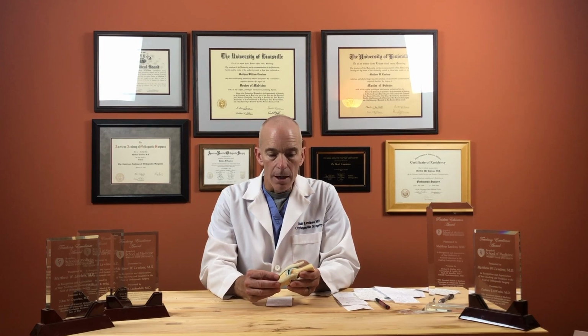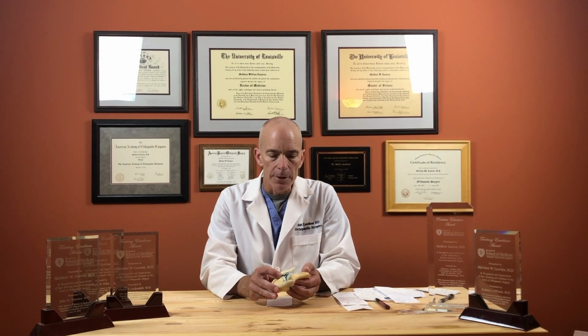There's currently a very popular way of doing it with what's called a robot. The conventional way of doing it is where you use various landmarks, you drill access to the canals, and you put cutting blocks on, and you pin those in place, then make the cut. You make 5 cuts on your femur, you make 1 on your tibia, and then cut for a hole in your tibia to help anchor the base plates in there. You can either use conventional equipment where, as I said, you find landmarks and lock it in place, or you can use a robot. The surgery is done the same way with a robot or conventional instruments. It's just how the blocks are placed and how the saw is being done.